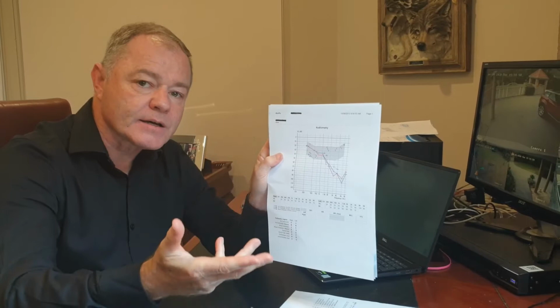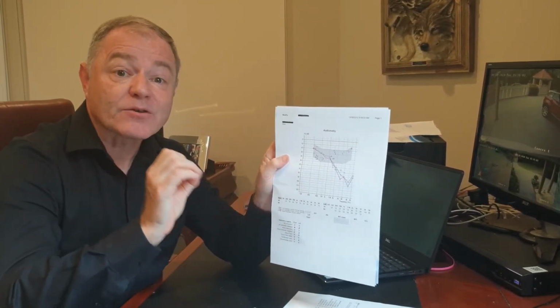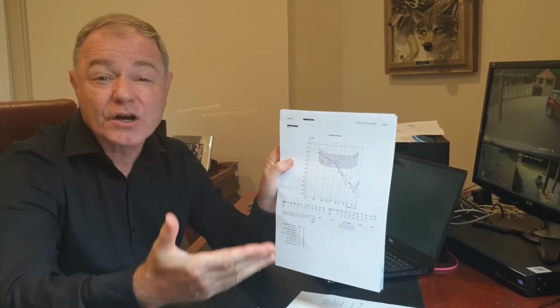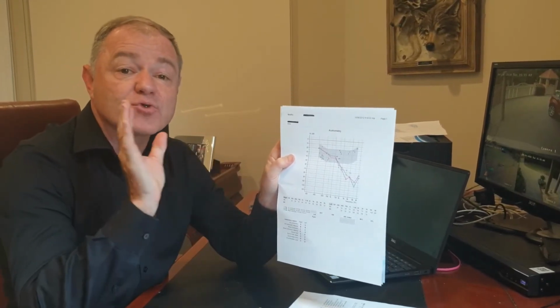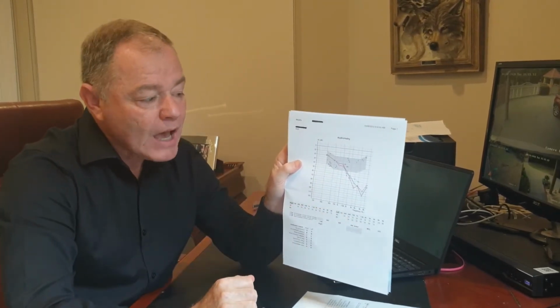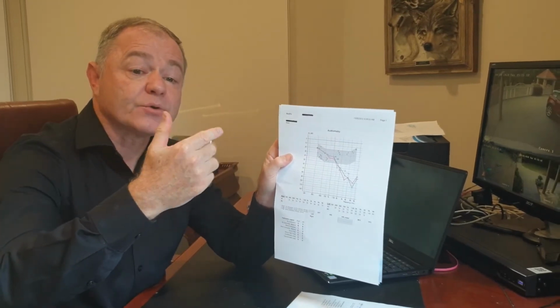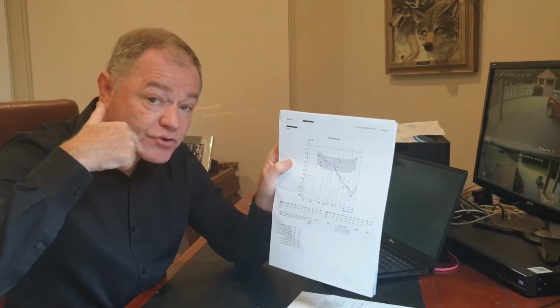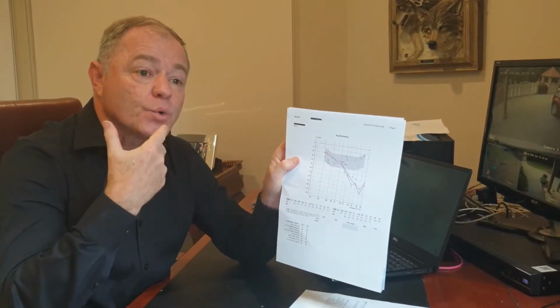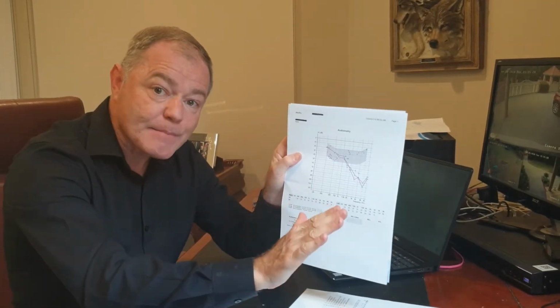And in the cochlea, there are approximately 20,000 tiny microscopic, what we call little hair cells. You can think of them as maybe little nerve endings. And so these nerve endings respond to that sound pressure wave as it enters that chamber. And then those little nerve endings, they will vibrate, and they'll basically create an electrical impulse that travels up the auditory nerve to your brain, and then you hear. So the first test we do with the headphones goes through that entire mechanism.